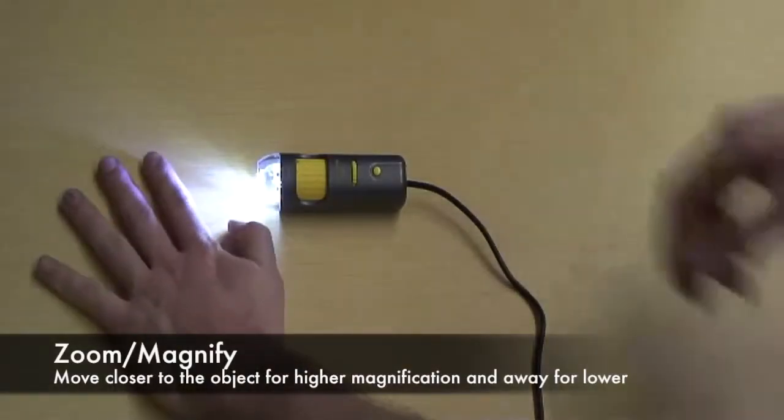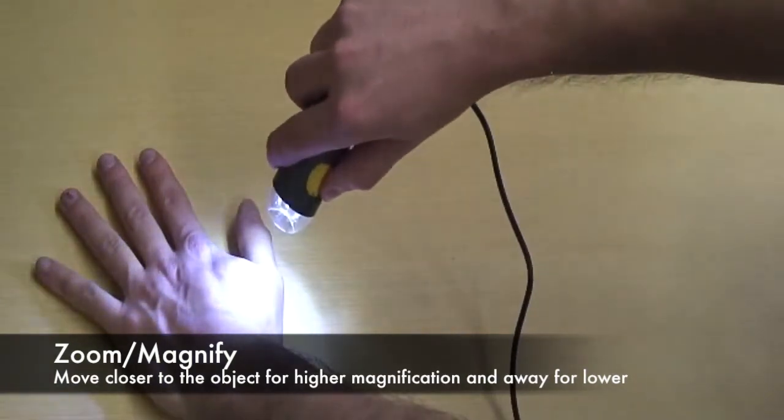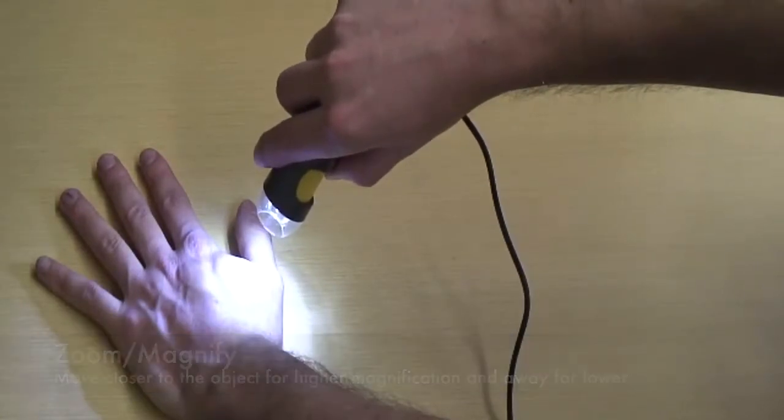To use, pick up the Mighty Scope with your dominant hand and hold the camera a few inches away from the desired area. Use your thumb to adjust the lighting control and focus knob.